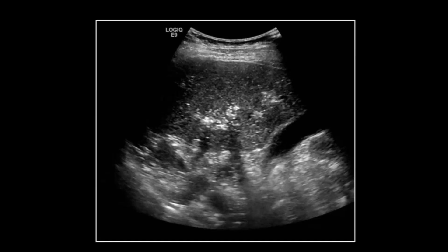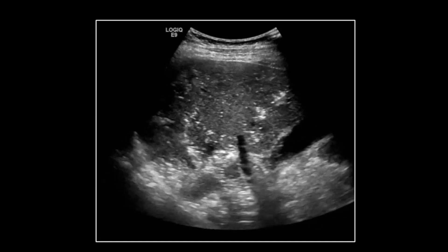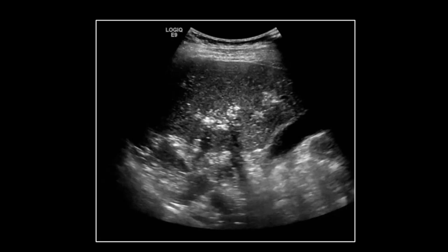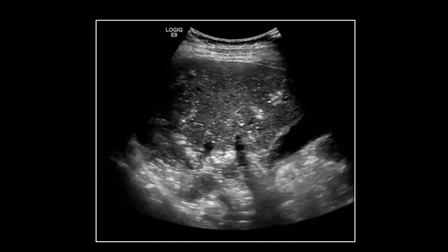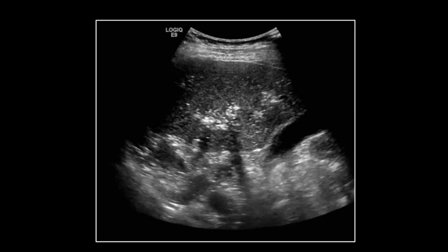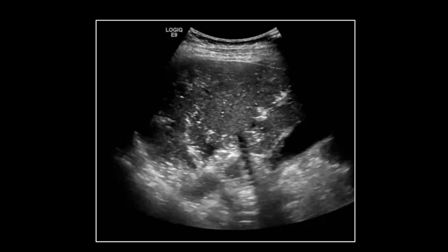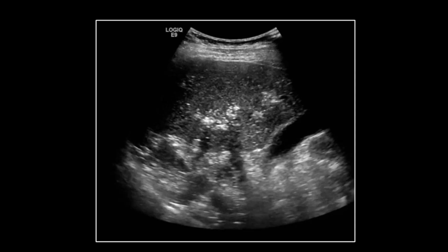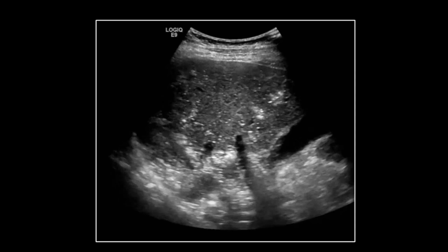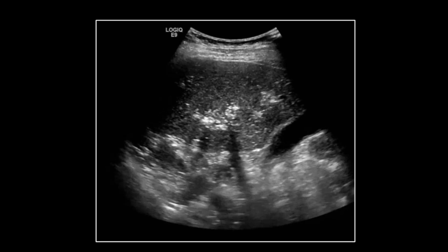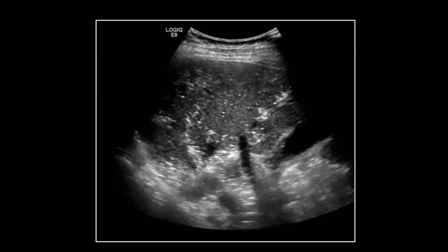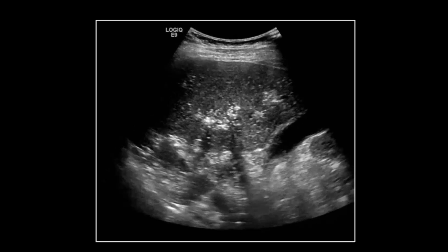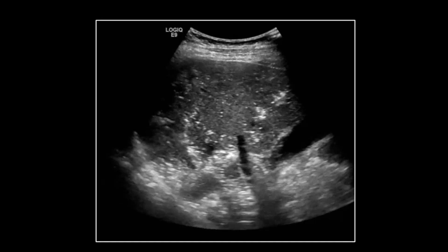A helpful hint: a lot of people go to calcifications when they see hyperechoic white dots spread throughout the liver, but those are not calcifications. When you get really tiny calcifications, they may not shadow, so absence of shadowing next to a small white dot doesn't definitively rule out calcium. However, most calcium that's dense or big enough will cast a clean shadow. With that many white dots throughout the liver and not one casting a shadow, you can look at that and say: this is not calcification.